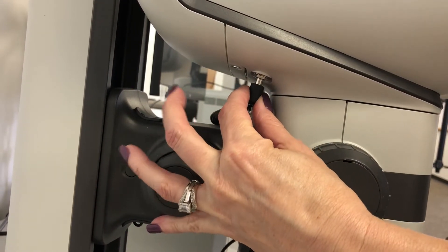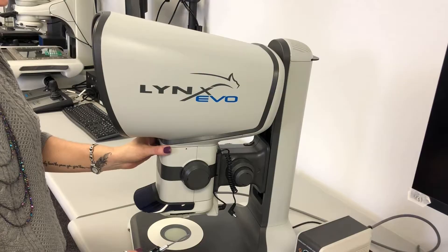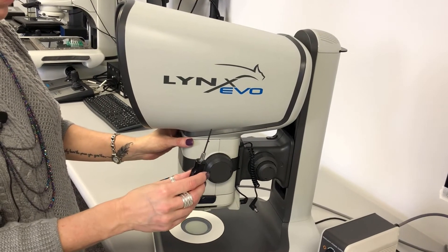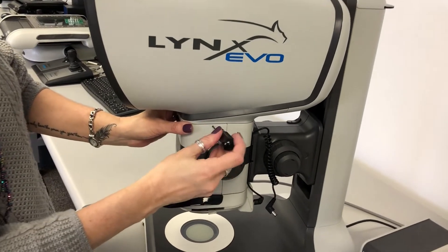The first thing you're going to want to do is disconnect the power cable from the head. Second, using a two millimeter hex driver, loosen the set screw.